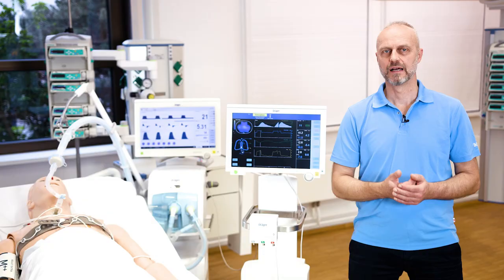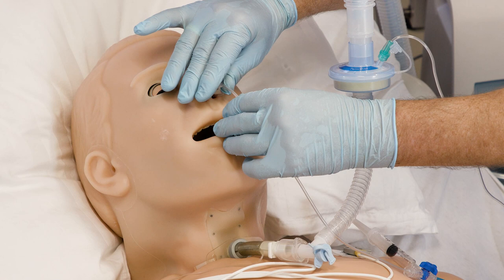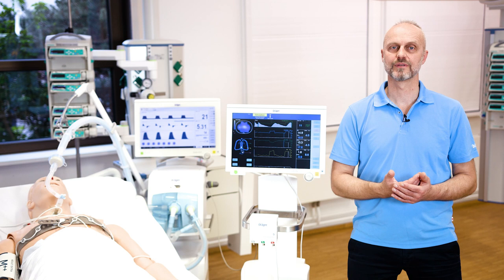After the occlusion test has been successfully passed, we finally secure the probe by fixing it to the patient's nose with medical tape. Now you can assess the information about regional ventilation distribution together with the pressure waveforms and derive parameters simultaneously in one view, complemented by several analyzing options. This information will bring you one important step closer to the full clinical picture of your patient.